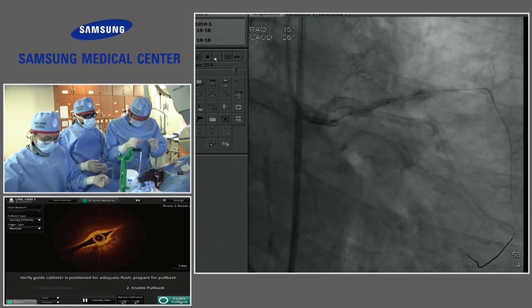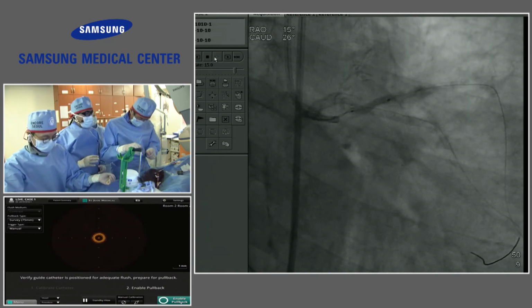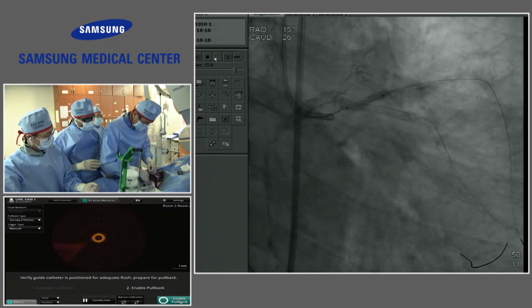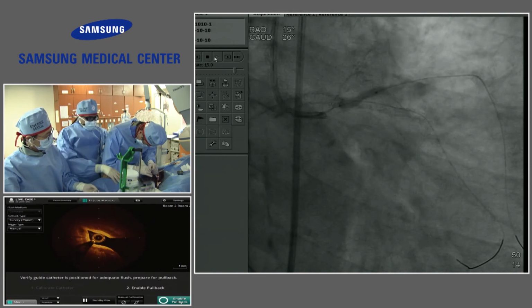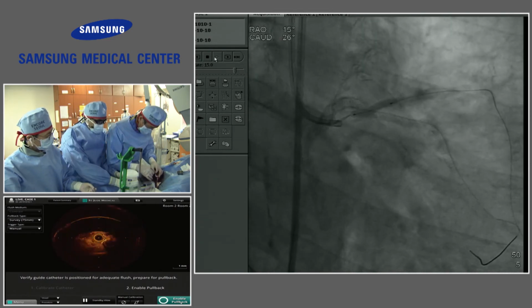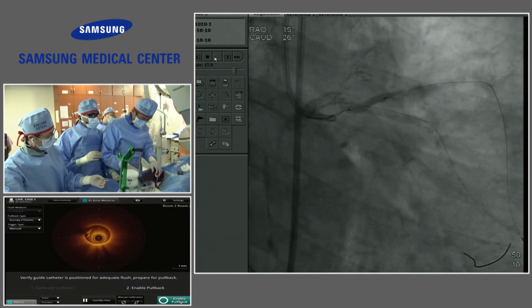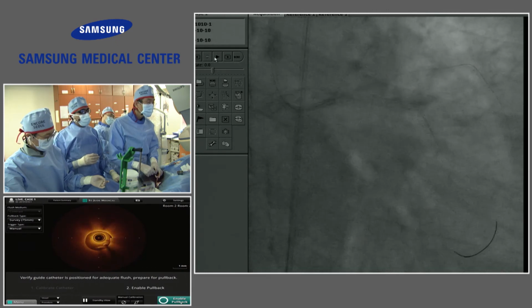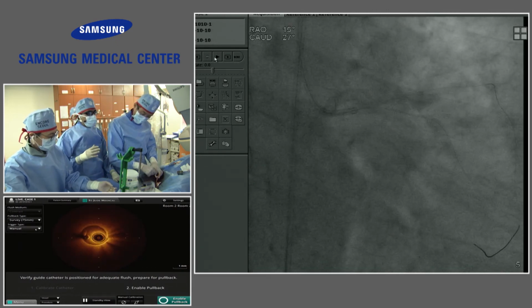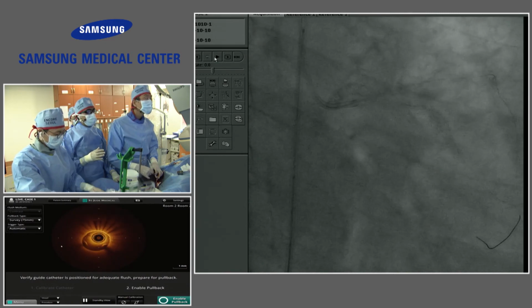In my opinion, the optimal lesion preparation strategy in that case is actually orbital atherectomy. The reason is because it precludes you from having to use multiple burrs, and it is also the best to orbit and cut down the amount of calcium. Rotablator, because of the wire bias, can very easily slide past this calcific nodule.